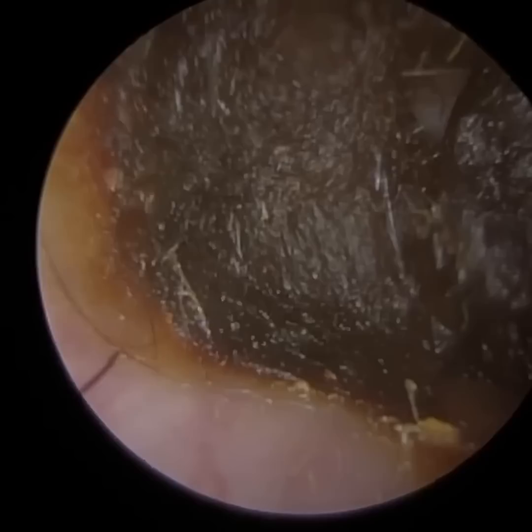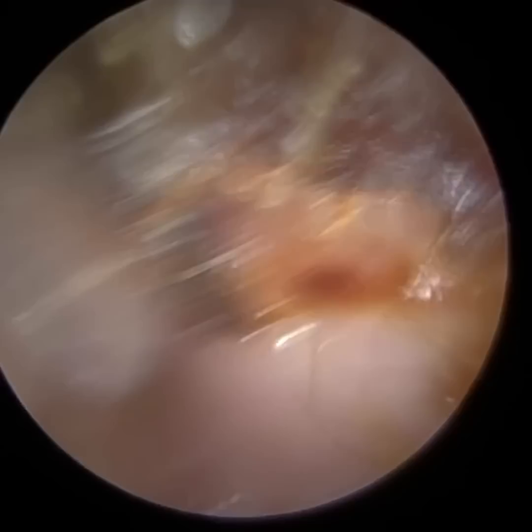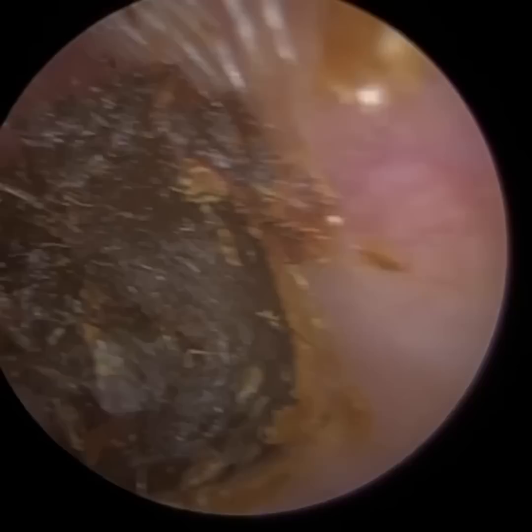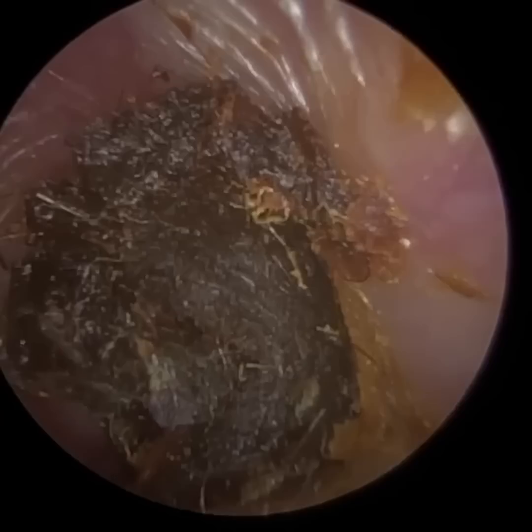This is patient one. They were really, really nervous, this particular patient, and they had really lodged the wax deep in their ear. This patient has previously informed me that they actually used cotton buds in the past, and it snapped off in their ear. And you would have thought that would prevent them from using cotton buds again, but they used them again, and it's really lodged. This is their left ear — you can even see the indentation, the imprint left by the cotton bud.